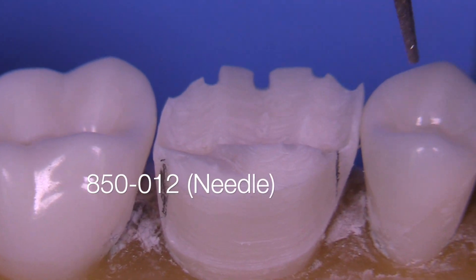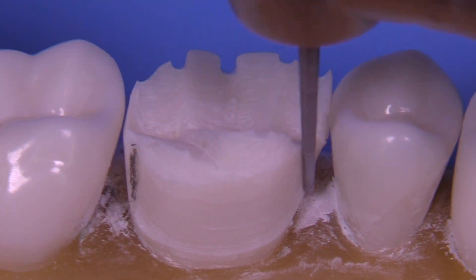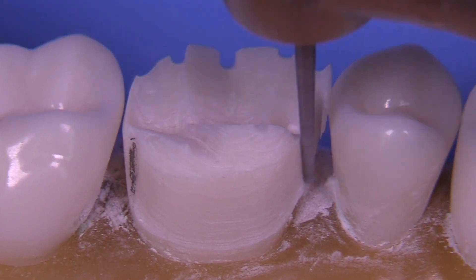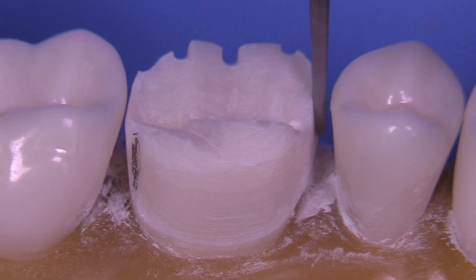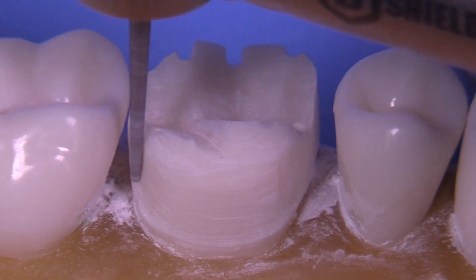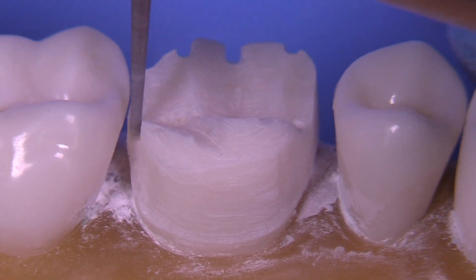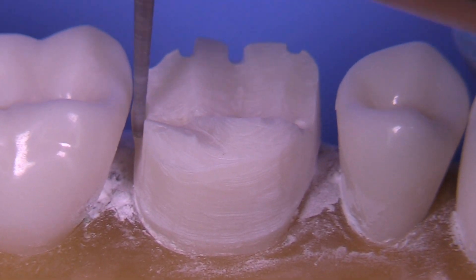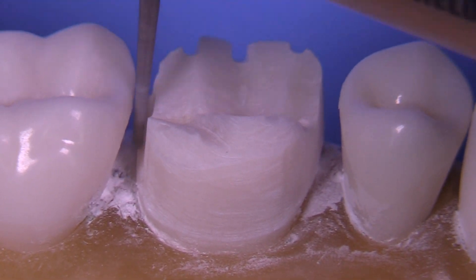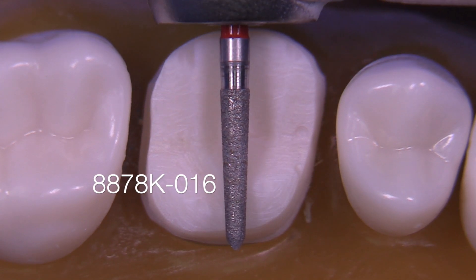Now we're ready for the needle-shaped bur. There are so many of these — this is an 850-012. Another one we like is the 859-010, which is a little bit thinner, but thinner burs become a little harder to control; they become more wobbly in the handpiece and are typically longer. If you use this by just stroking through the interproximal in an uphill manner, like you're walking upstairs — starting with the tip, engaging the tooth, then pushing it upward — you can eventually paint through the interproximal. Then while you're there, just go around the tooth several times and get it more even.